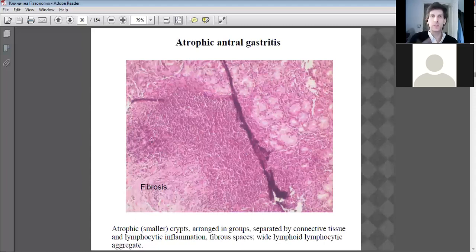Now, with too many lymphocytes, what you get is the death or the destruction of cells, because they're trying to destroy cells that have been damaged or infected. And as a consequence of that breakdown or digestion of the dead cells, you get the aggregation. Okay. This thing here in the middle is just an artifact from the staining.